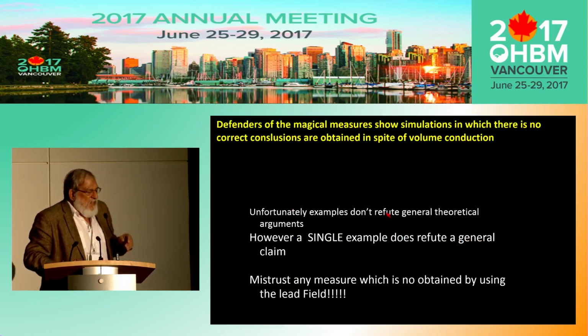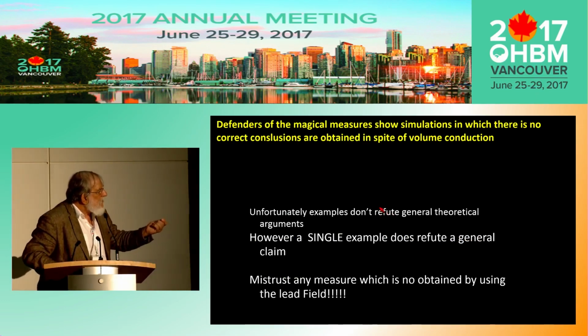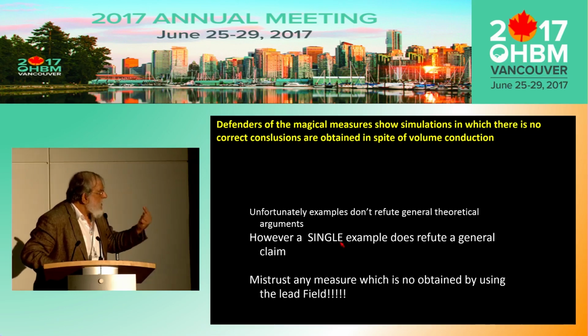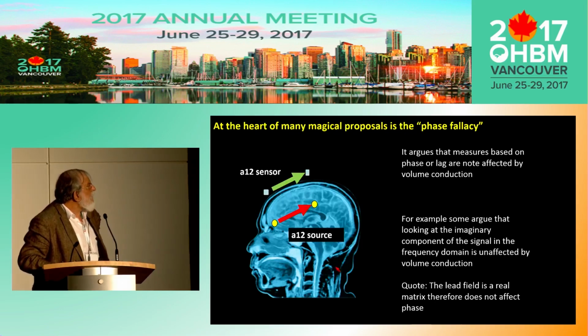I have to mention that people sometimes come forth and say, this is the new measure that will eliminate the need for looking at the lead field. And they put one or two examples. Unfortunately, isolated examples don't prove a general point. But a single counterexample, which can be done by simulation, can refute. So my message is: mistrust any measure which claims to be looking at brain connectivity directly and does not take into consideration the lead field.